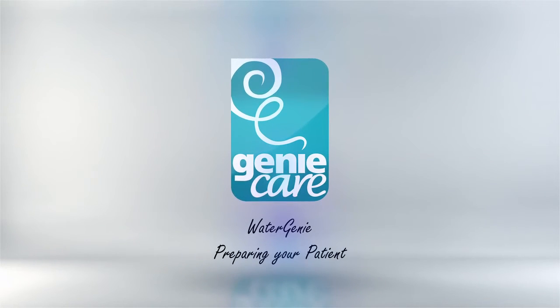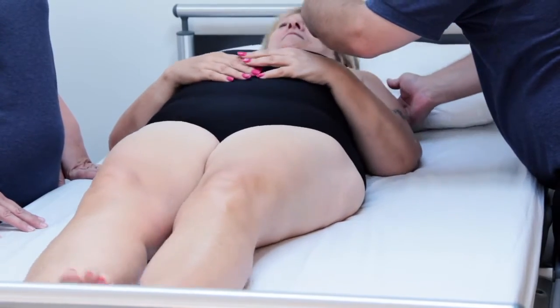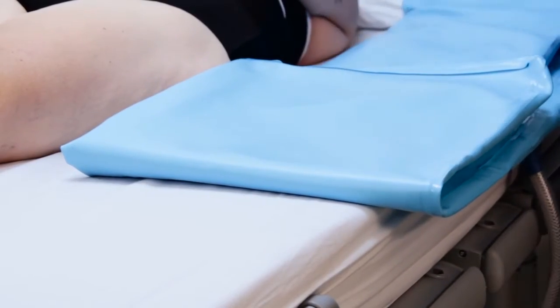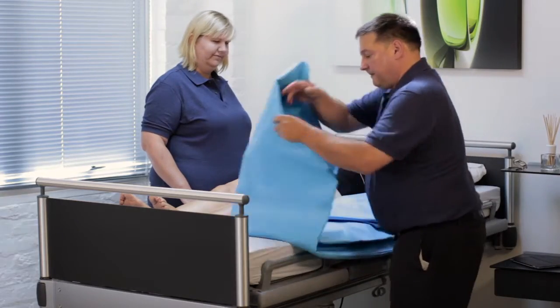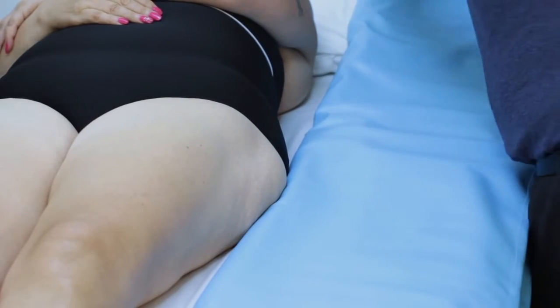Preparing your patient. You can use the Watergenie with any mattress. Lay the bed flat. Place the folded bath onto the edge of the bed with the waste pipe down. Unfold the bath making sure that the inflation valves and the waste hose are nearest to your side of the bed.